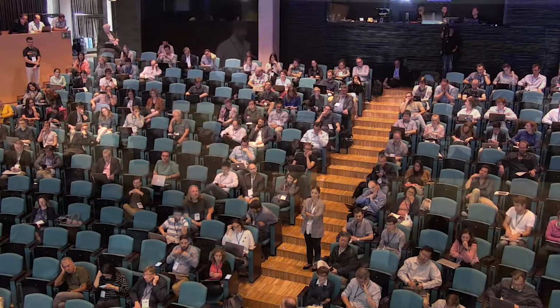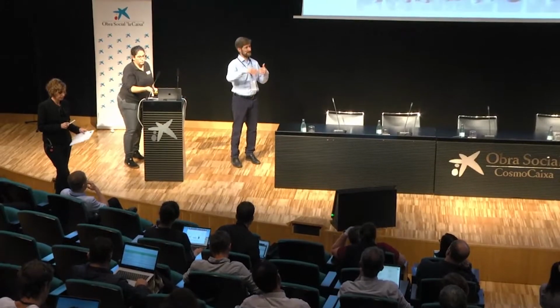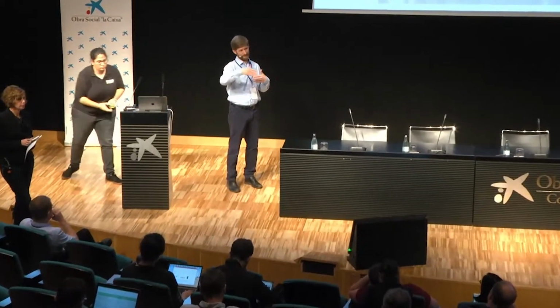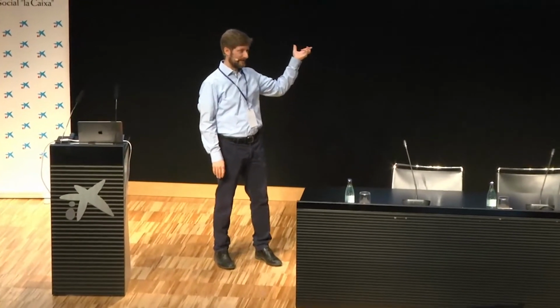So that's an excellent question. Basically, how do you compare multiplex measurements across hundreds of slides if you want to go through a large cohort or in a clinical setting? So for the study that I've shown you in the end, we had a tissue microarray where all of the tissues were arrayed on the same glass slide, or actually it was a few of them. And then you can do the antibody staining across all of the samples at once. And then also, that's how you mostly avoid the artifacts you can introduce by using many glass slides.